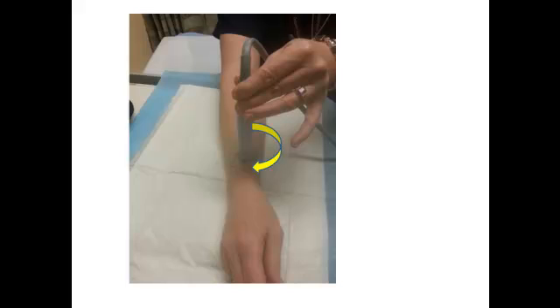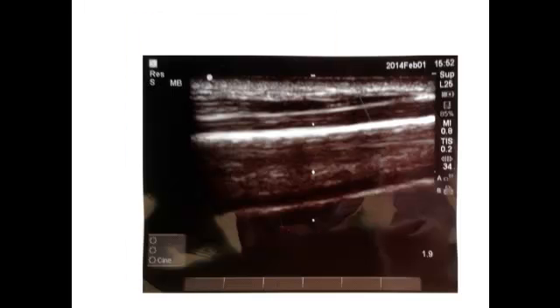Then you turn your probe 90 degrees so that you're running along the long axis of the radius, parallel to and hopefully right over top of it. You should see a line like this — a bright white line in the middle of your ultrasound view — that represents the top of your radius. The next picture shows the probe overlying the radius; again, it's a little bigger than what you'd actually see, but it represents the radius.